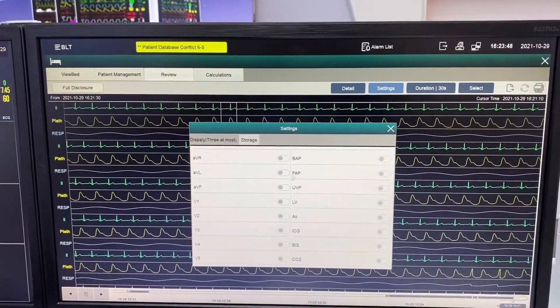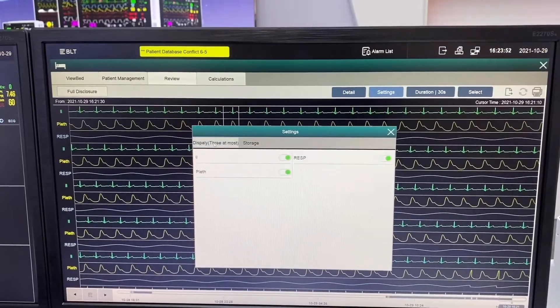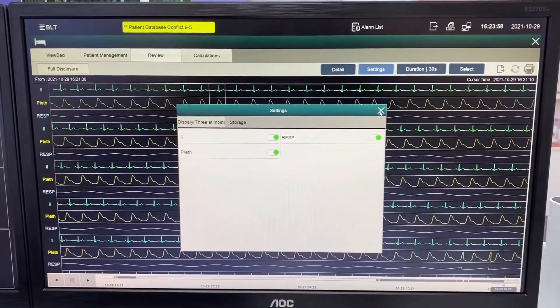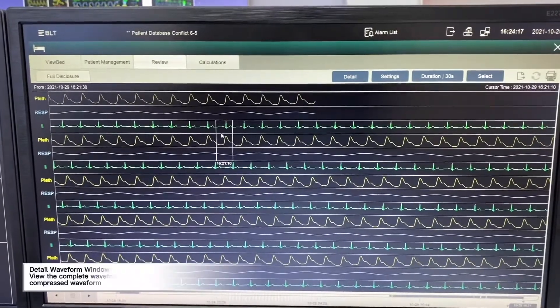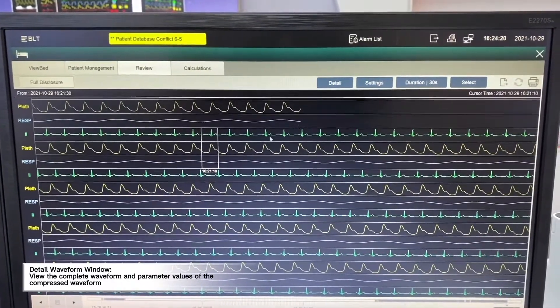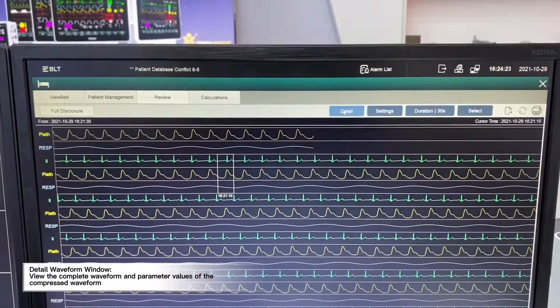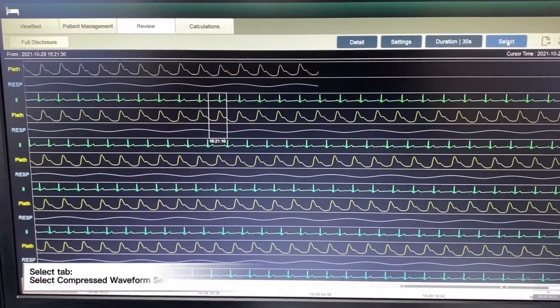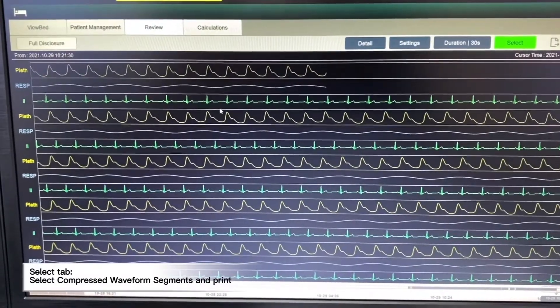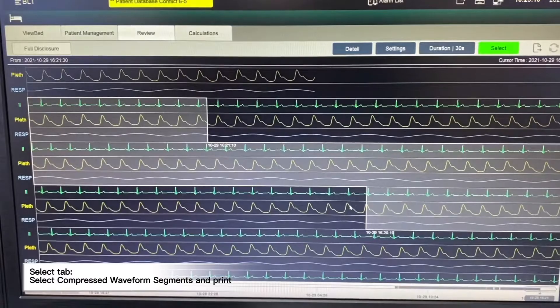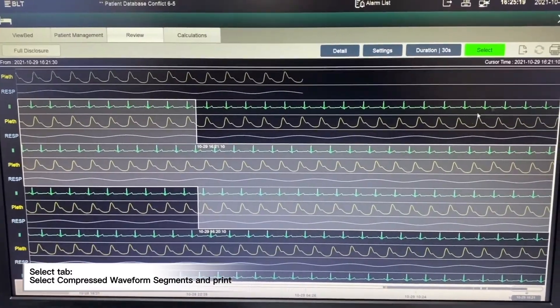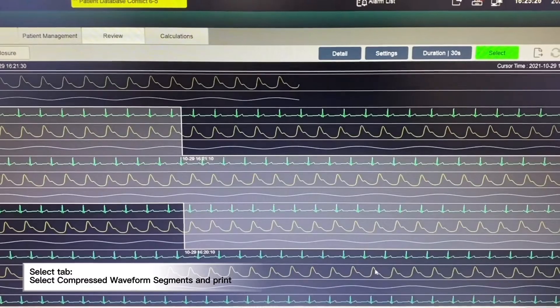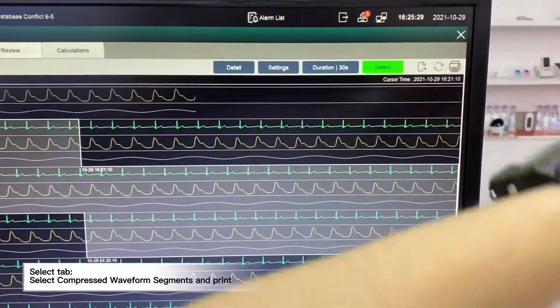In the full disclosure page, we will be able to open all waveform storage. The display page supports up to three waveforms being displayed at the same time. If there is an abnormality detected and we want to focus on that part of the ECG, we can click detail to open the detailed page for ECG analysis. We also have a selection button — once we click it, we can select a period of ECG waveform, then click the print button and it will print from the connected printer.